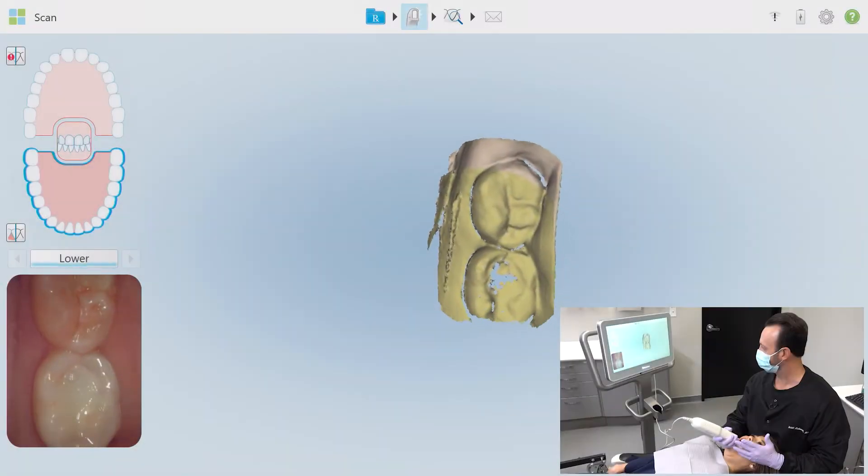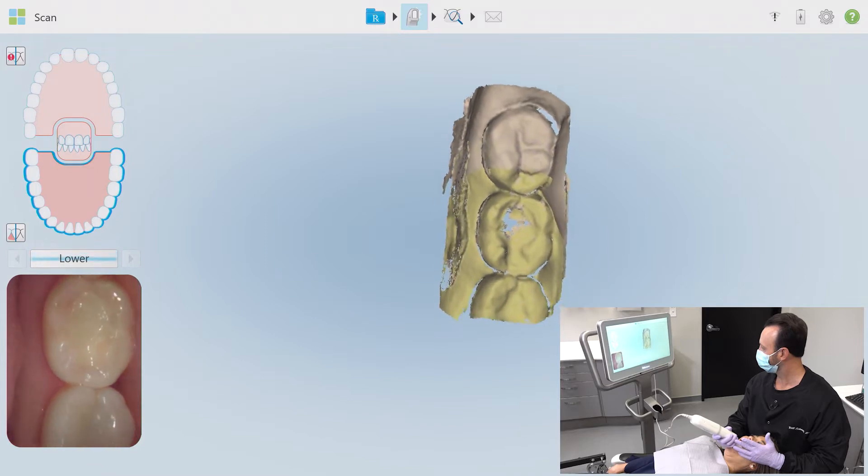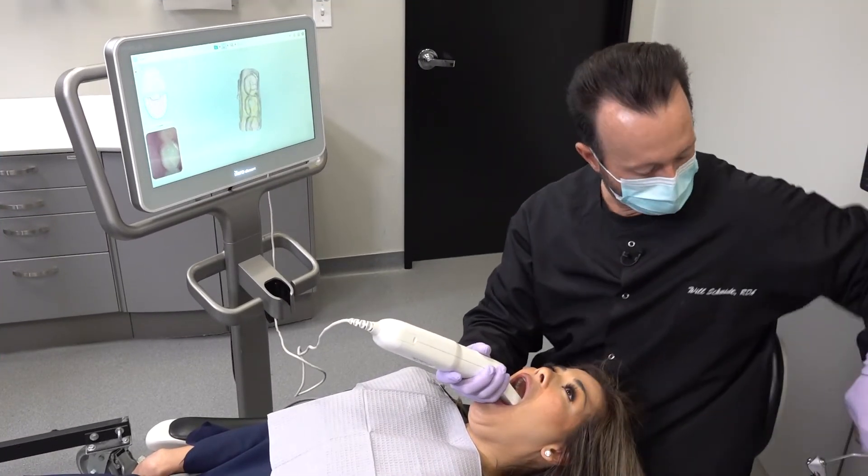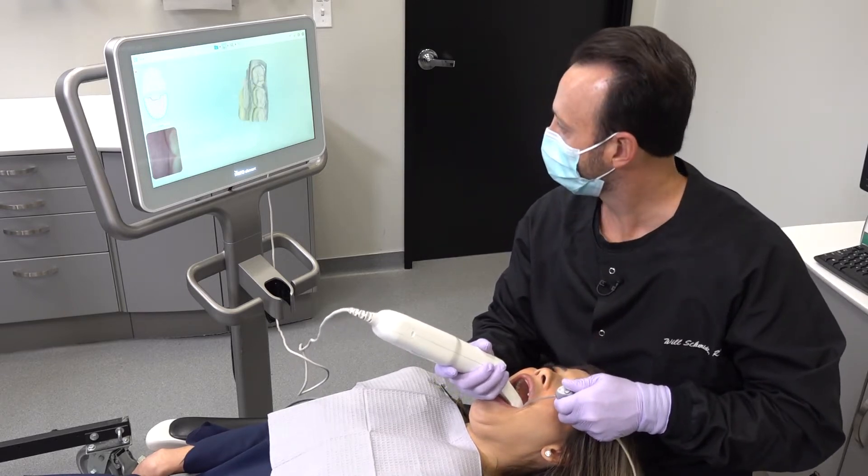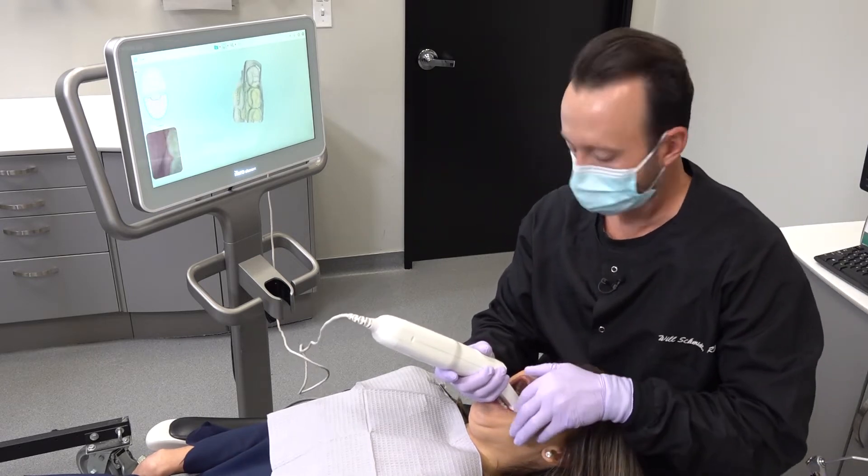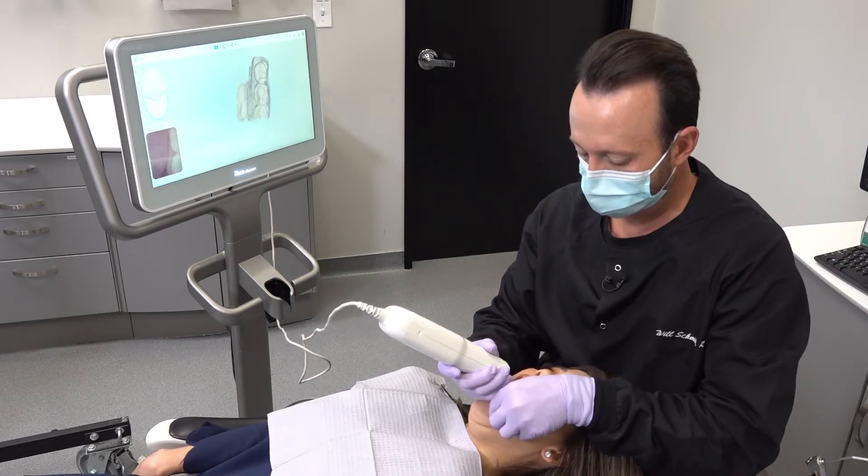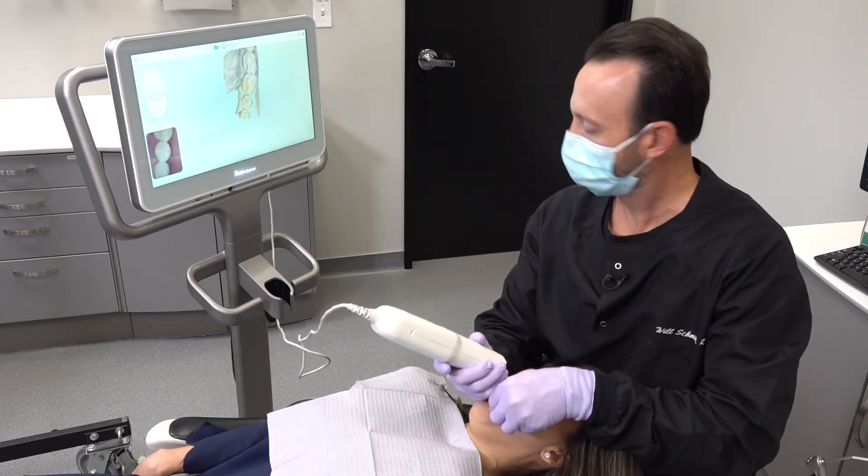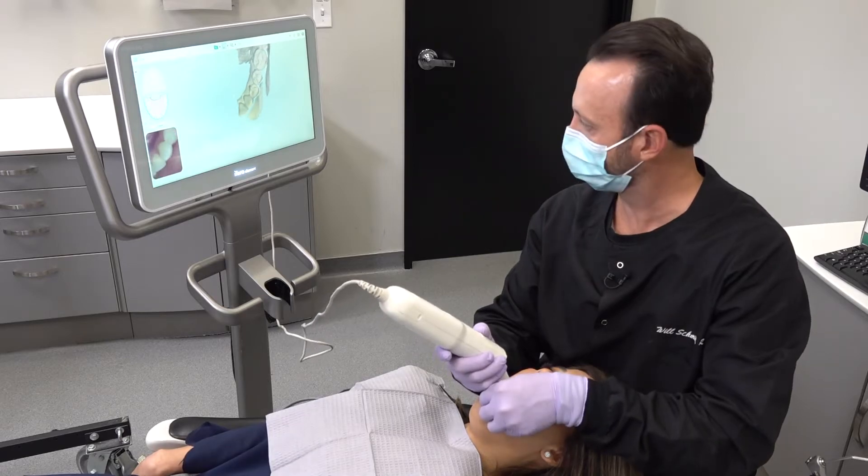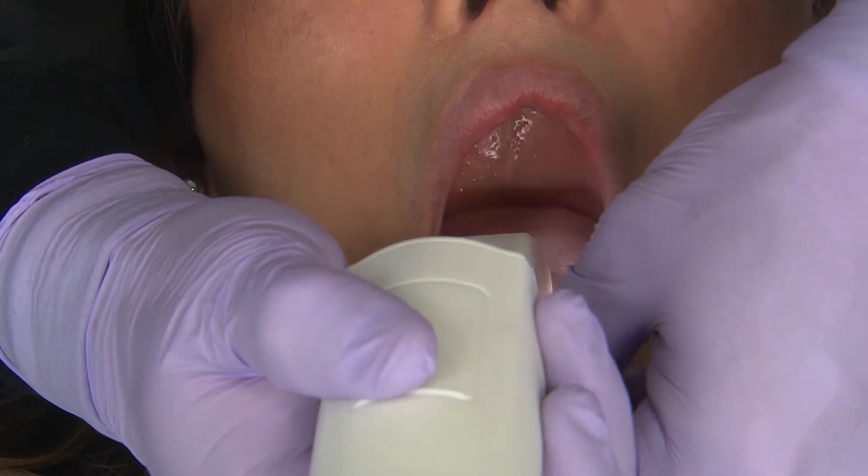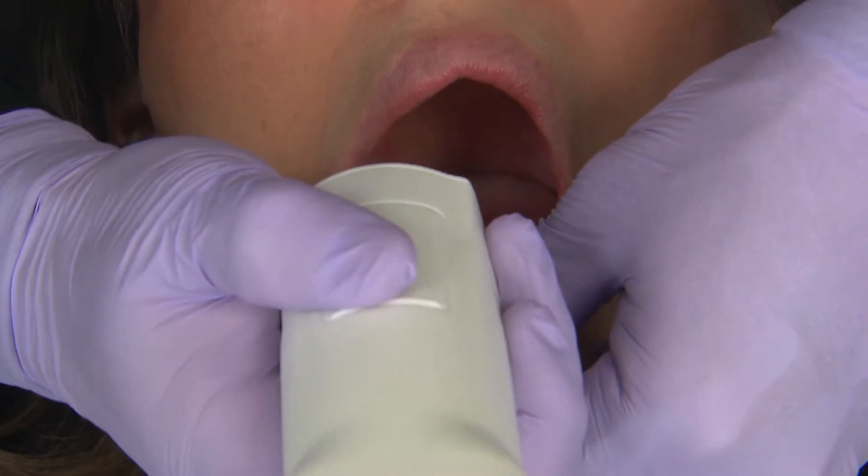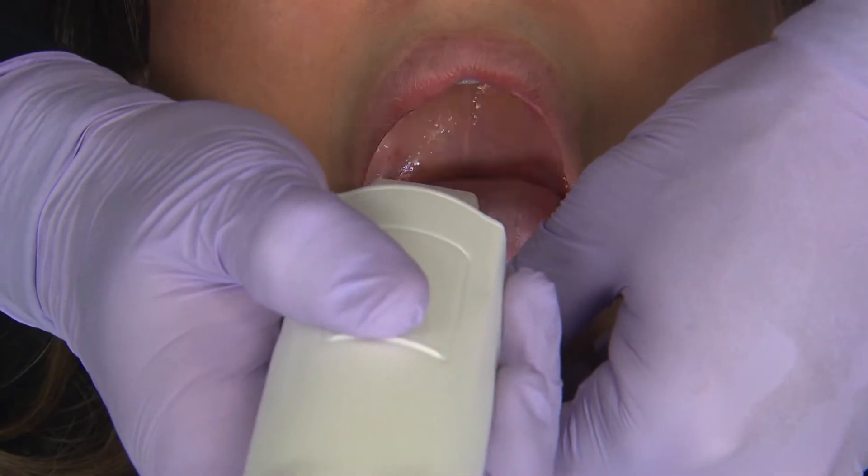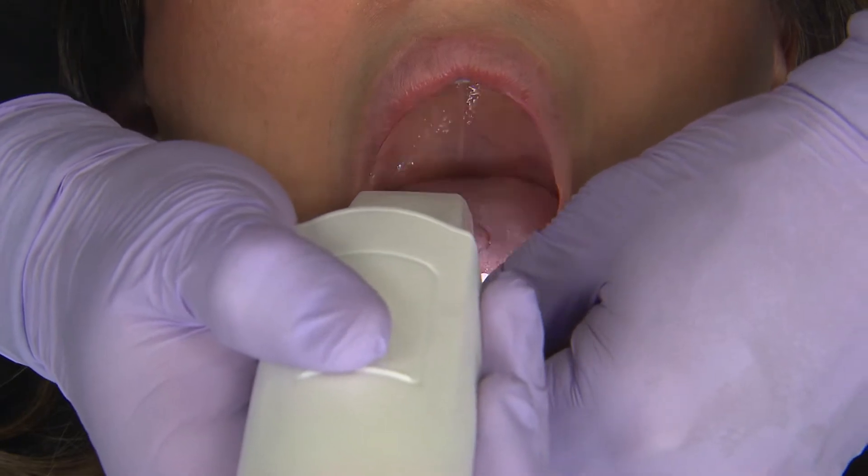Let's get started with this live patient example and talk about seating position and wand technique. It is important to feel comfortable while scanning. The more I am straining while performing a scan, the more I'm going to start to get fatigued. My preferred position is roughly 12 o'clock in relation to the patient's body, and I'll position the scanner either to my left or right at 5 o'clock or 7 o'clock respectively. I'm holding the scanning wand in my dominant hand with my palm and fingers facing upwards. This initial hand posture is exactly the same whether I'm scanning the upper or the lower arch. My opposite hand is always standing by to retract, to suction, to provide a fulcrum, or even act as a stabilizing guide.